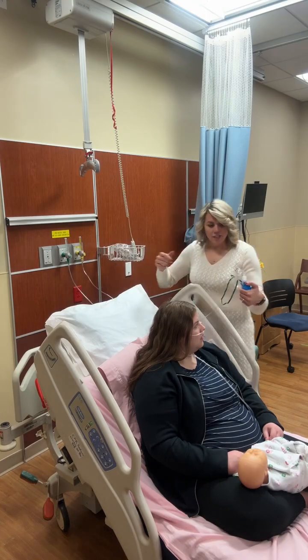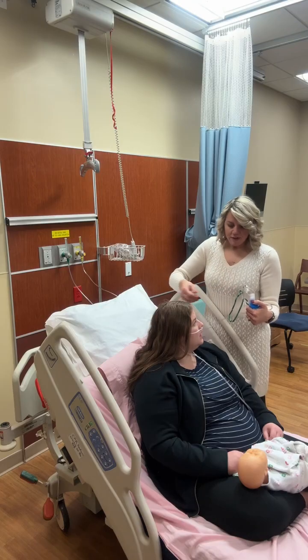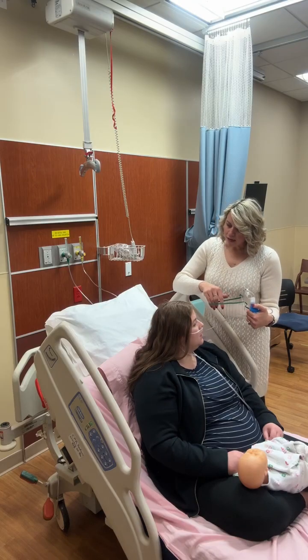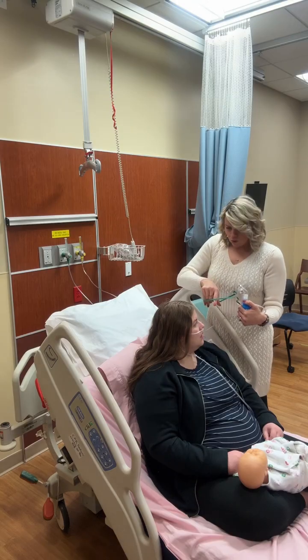All right. And Ashley, you see that mist coming out. This is going to go into your face. I just want you to take some deep breaths in and out. Okay. And take a breath every once in a while and hold it, and then breathe normal. Okay.